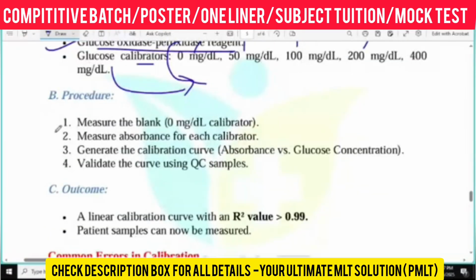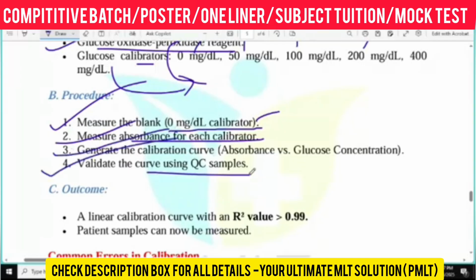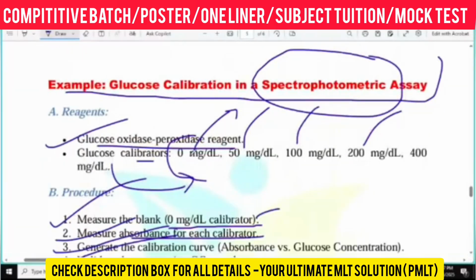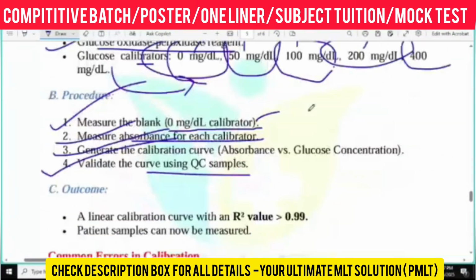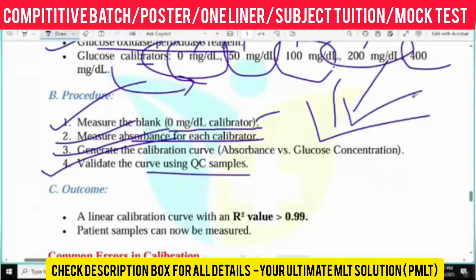The procedure is to measure the blank with the 0 mg per dL calibrator. After that, measure the absorbance for each calibrator. After that the calibration graph will be generated. After that, validate the curve with a QC sample. Firstly you use 0, then 50, then 100, then 200, then 400. Nowadays machines will give you the calibration graph. Yes or no? You have to match it with the quality control sample. After that, the calibration section is done.